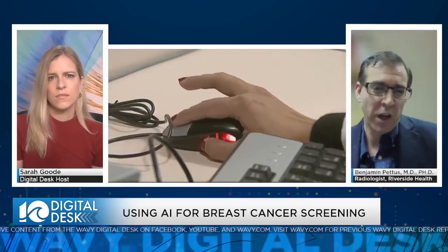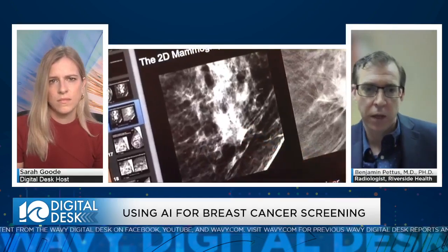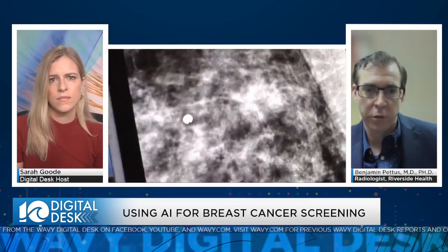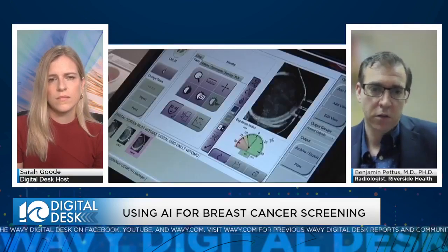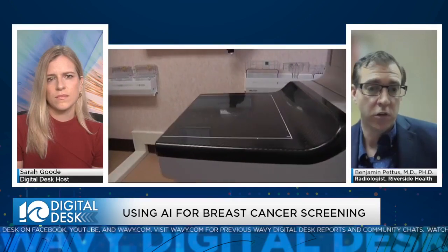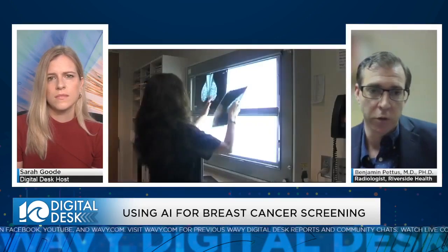So really there's kind of a synergy between the other efforts we're making with early detection, 3D imaging, wide angle 3D and things like that, and now having this second evaluation that's occurring. So that's kind of what we're trying to do, see if we can get to a situation where we can find things small and early as possible.